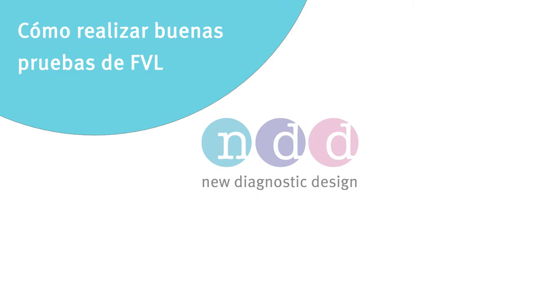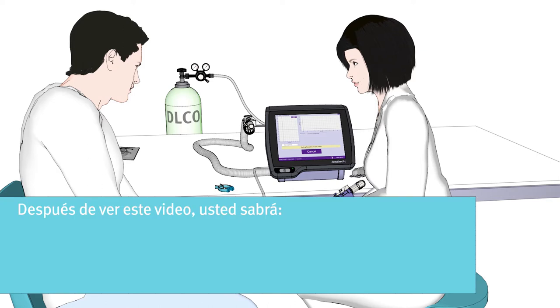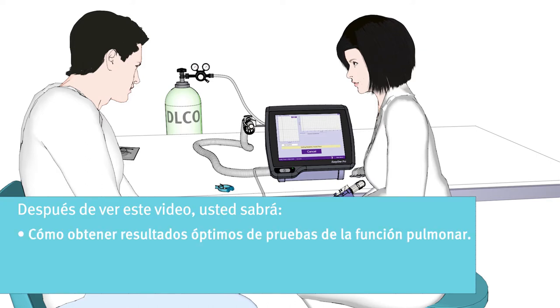How to perform good FVL tests. Hello and welcome to this educational movie. Thank you for taking the time to watch this short video. After watching this video, you will know how to get optimal test results out of your lung function test.